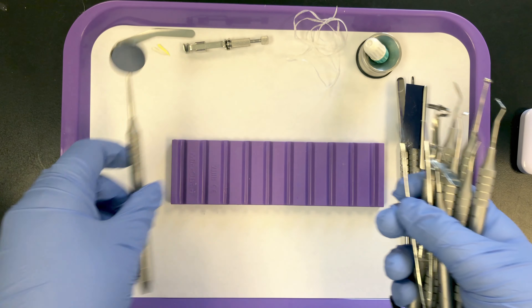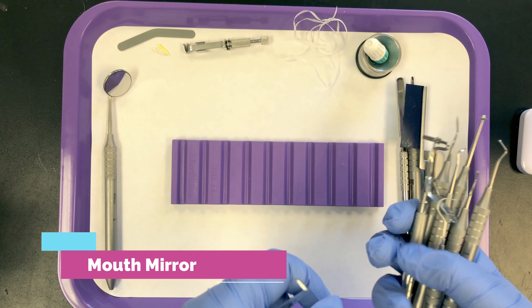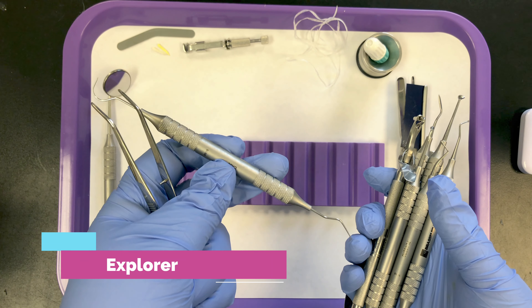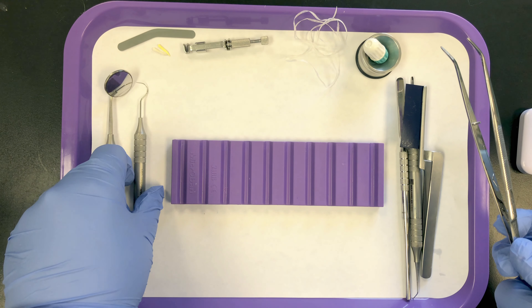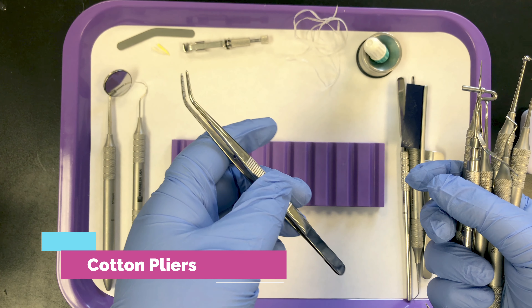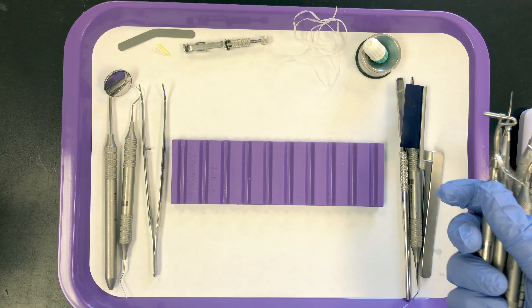In order from left to right: mirror, for indirect vision, retraction, and illumination. Then we have the explorer to explore for irregularities and examine the teeth. Then the cotton pliers to pick up and remove small objects from the mouth. That's our basic setup — they always go first.